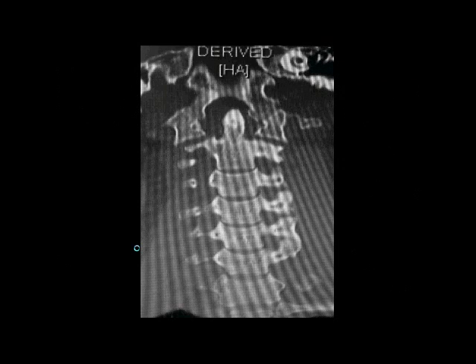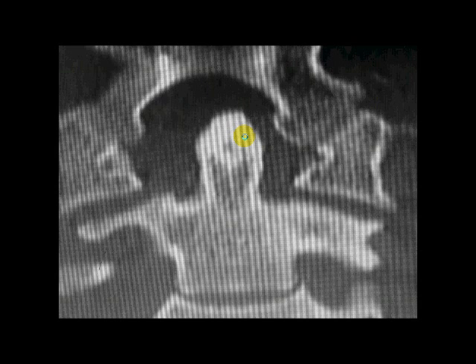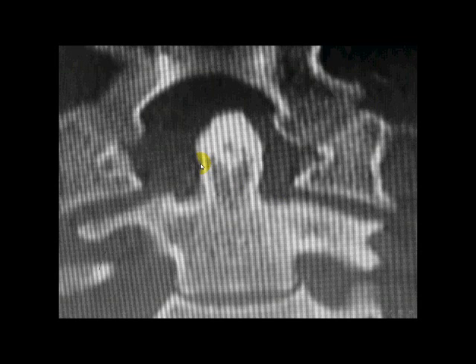So we have four areas of disruption in the C1 ring. This was confirmed by a 3D reconstruction of the cervical spine, and as clearly seen on a magnified view, the odontoid process is not in the center of the C1 ring. There is displacement of the C1 articular surface, not overlying C2 carefully, especially on the right side, and the distance measured is not equal on both sides.